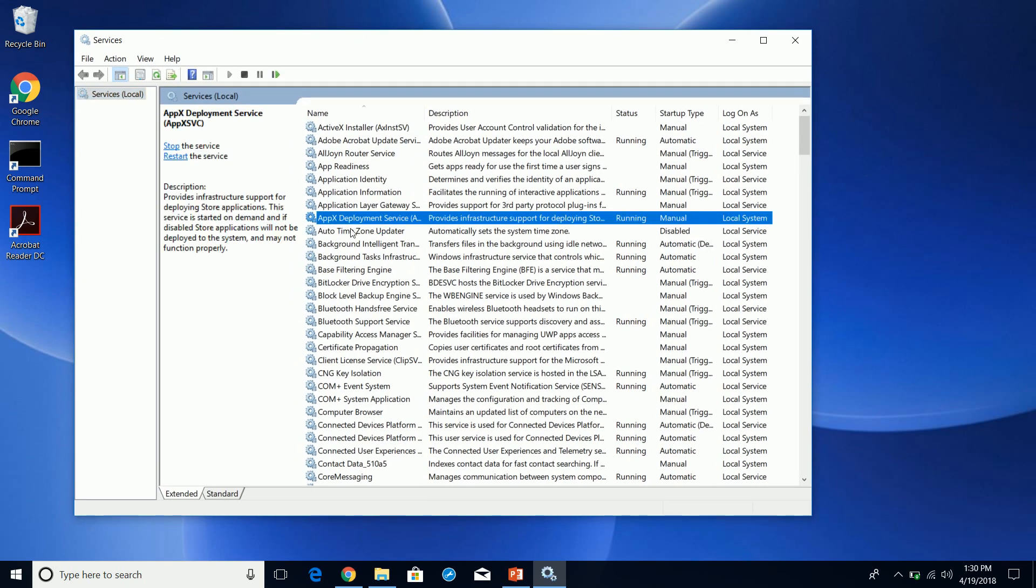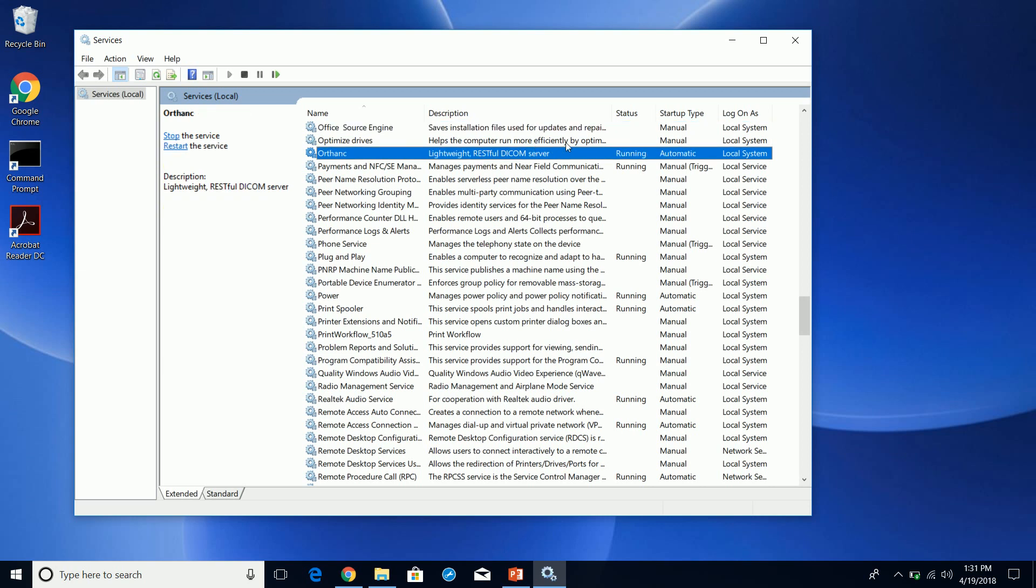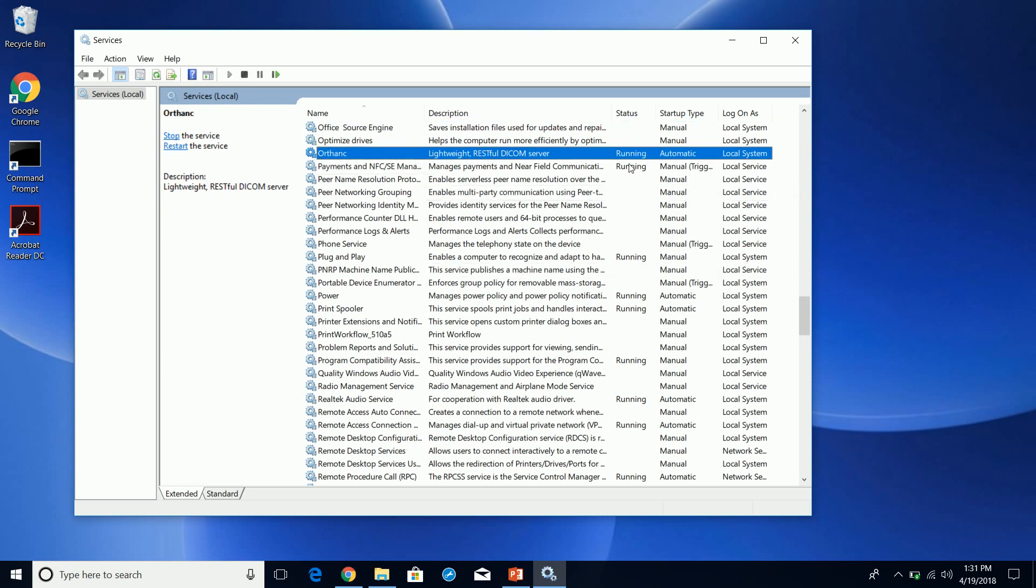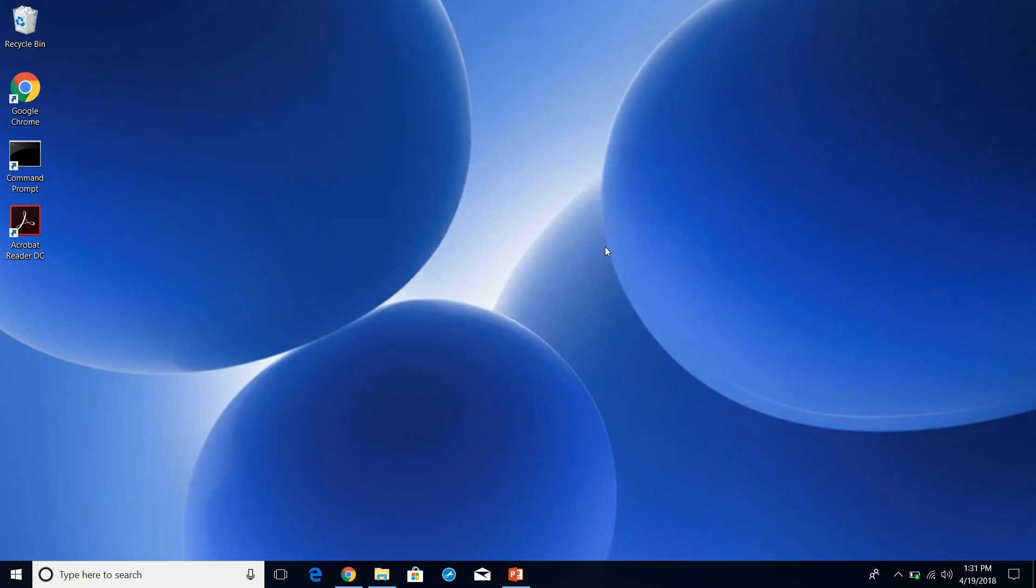The install is complete. You will notice that if you go into services, the install will place the Orthanc service here running, and it'll set it up as automatic. It's running. That lets you know that your DICOM server is actually running at this moment in time, and this service needs to be running in order for your DICOM server to function properly.